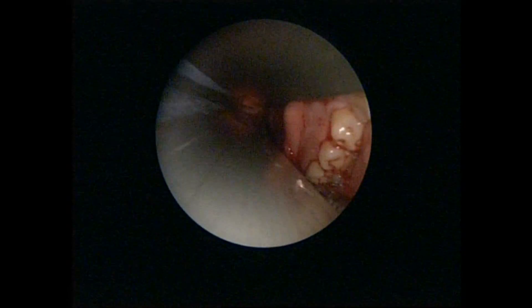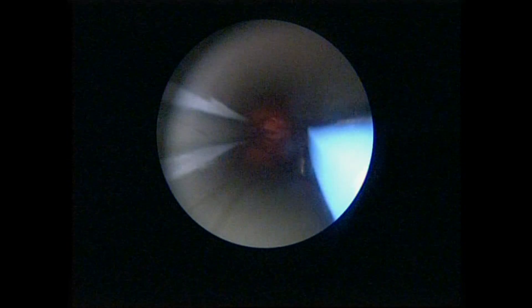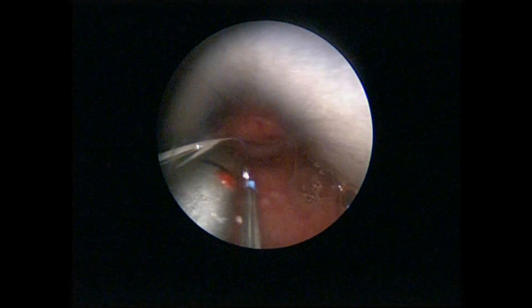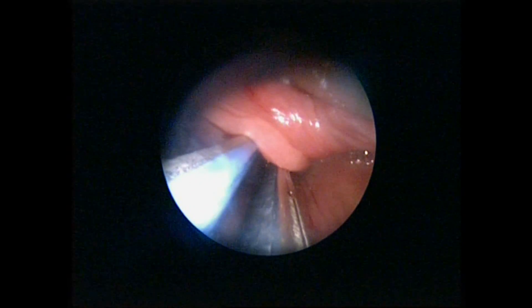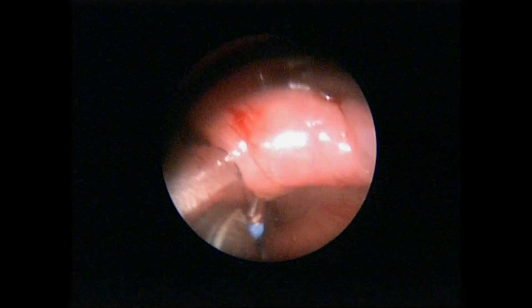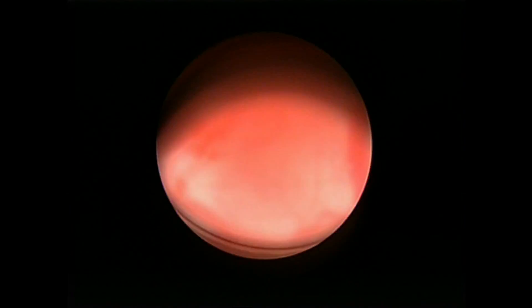The scope is positioned at the tip of the septum and using an endoscopic stapler, like the one in the picture, we will try to grasp the septum. This endoscopic stapler simultaneously cuts the mucosa and the cricopharyngeus muscle and at the same time staples the edges of the mucosa together water-tightly. This way, we will unify the lumen of the diverticulum to the lumen of the main esophageal tract.